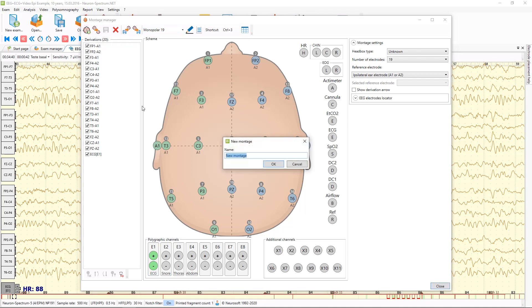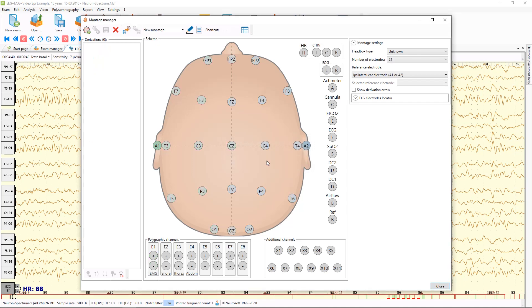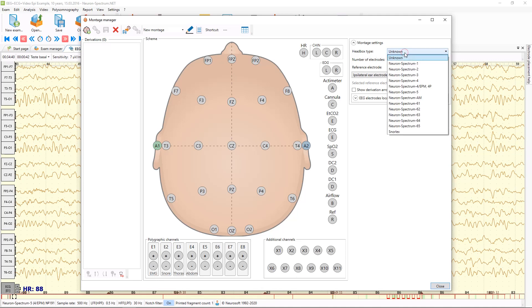Let's try to do it. You can type the name of your new montage. And from the right side you can select different settings of the current montage — for example, you can set up the EEG headbox from this list.